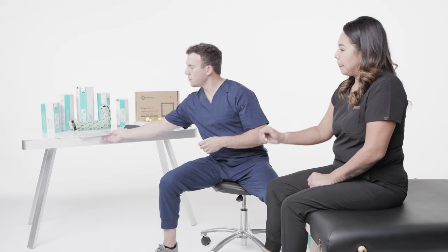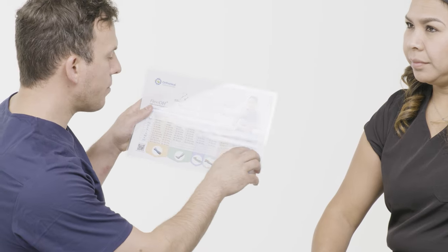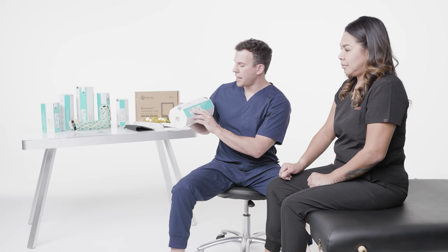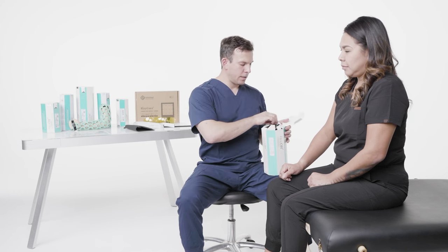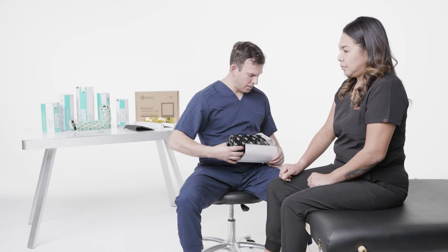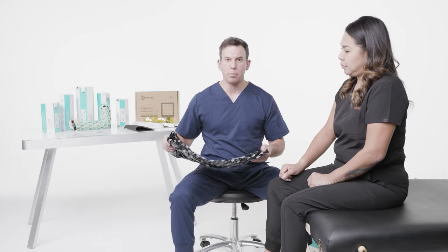So I have my measurements. I take a look at the chart, and I can see she is right as a medium. So I'm going to make sure that I have a full arm mobilizer medium. I'm going to check the expiration date, make sure it has not expired, and then I'm going to open up the product and take it out of the box.